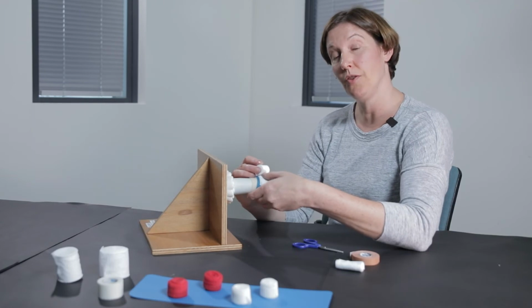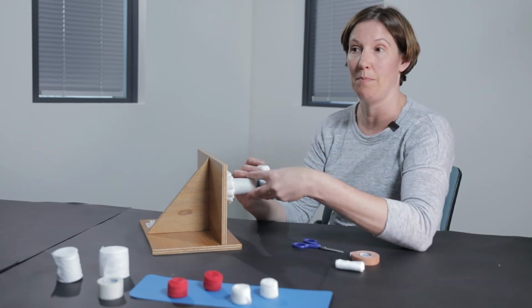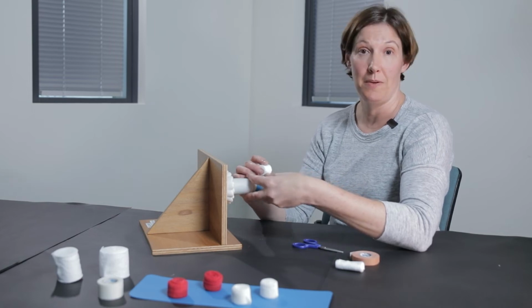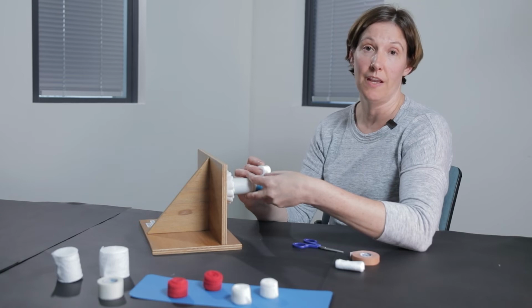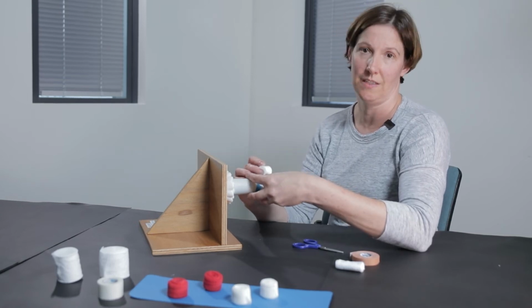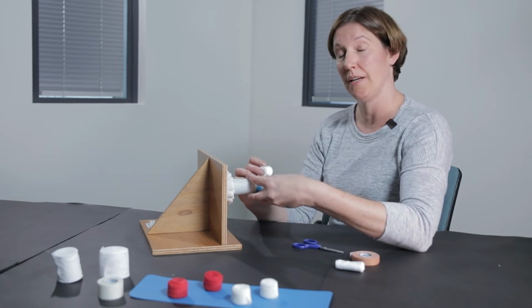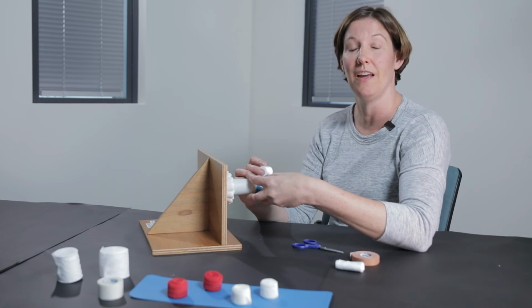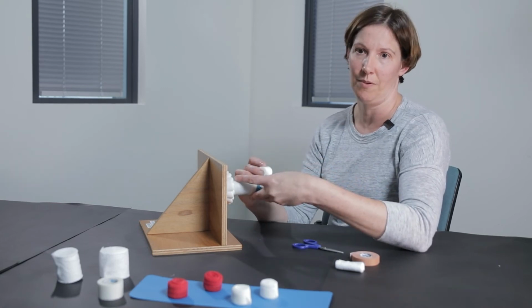I guess one of the other strategies that's really important is thinking about completing your hand wrapping after your baby has had a feed, or after having pain relief that has been recommended in conjunction with your treating team. So those are some times in the day, if they have had a feed and they have had their pain relief, that can make dressing a little bit easier for them.